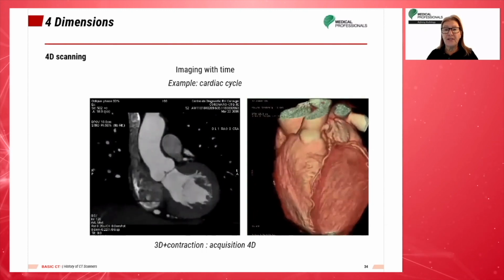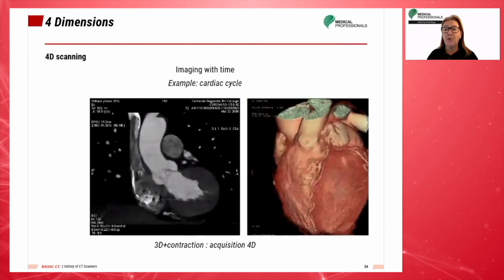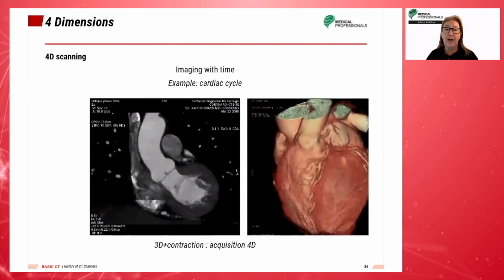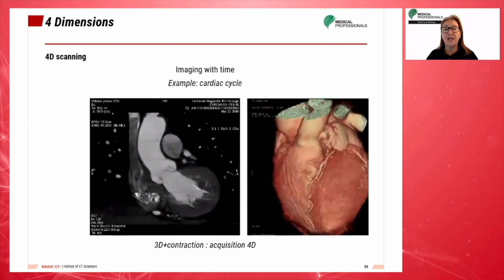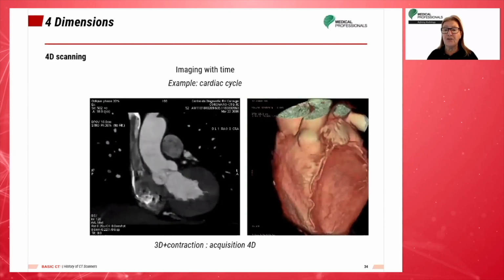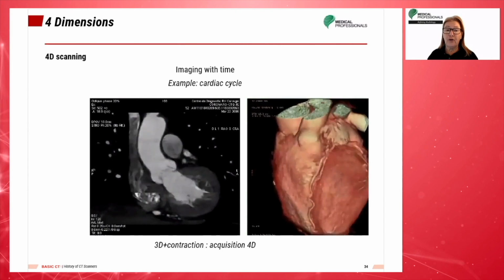In 2007, the 320 slice Aquilion ONE multi-scanner CT was introduced at RSNA. This scanner can be used in neurological and cardiac imaging and other body applications where entire organs can be scanned very quickly.